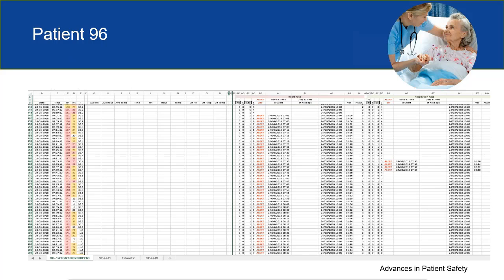And he created this model, and we could see from this that the alert would have been generated on the sensor a whole 3 hours and 8 minutes quicker for heart rate and 2.5 hours quicker for respiratory rate. So we could see that in real time, we were certainly picking these patients up significantly quicker than standard monitoring on the wards. And this is just one example of this, but we have several that we're analysing at the moment. Again, in the context of sepsis, these several hours difference can make life-changing effects to patients.